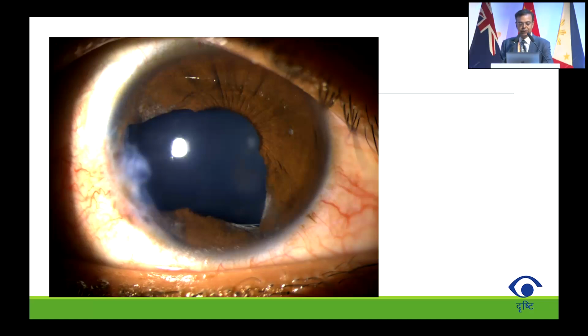So there was quite a bit of iris tissue loss, and there is a big sphincter tear over here. This is torn because that's where it was prolapsed, and there is also a lot of tissue loss here. And again, you can see the cut edge of the sphincter. I was trying to figure out how I'd be able to repair the iris at this point, because while I do a lot of single pass 4-throw pupilloplasty, this would have required me to first suture this, and then we would still have a big defect here. I thought this might not be a great case for a single pass 4-throw kind of repair, because it's almost 150 degrees of tissue loss.